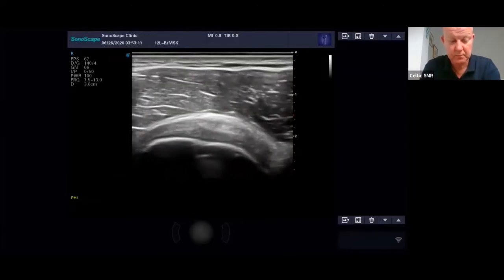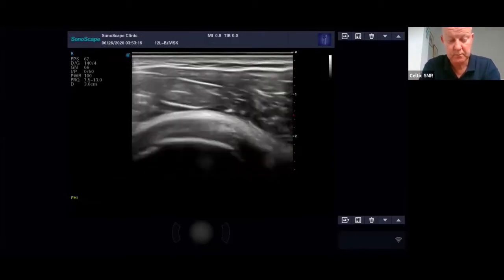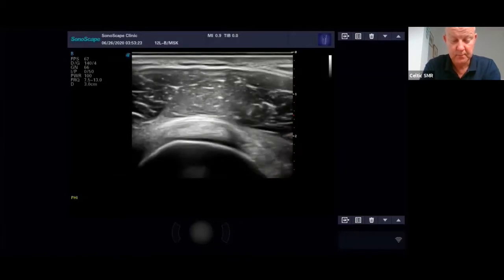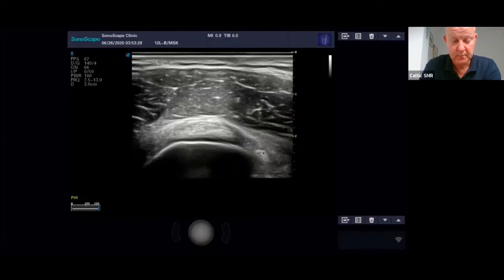Now you can see that I can't see the biceps tendon. I've just realised that Abid's in the Crass position. So if I move him back into the modified Crass, I now have the biceps tendon, which is here. So that's the landmark. So that's just changing that position. I could see that, but I couldn't see it before. Okay. And then this is the tendon, and this is your free edge here. There's a common place to get tendon tears.